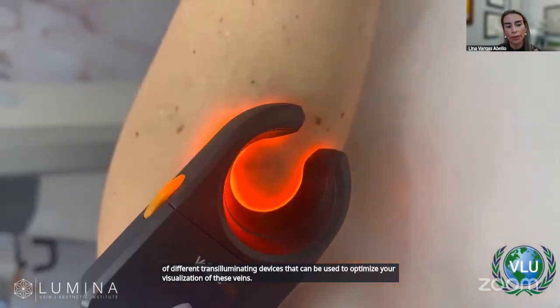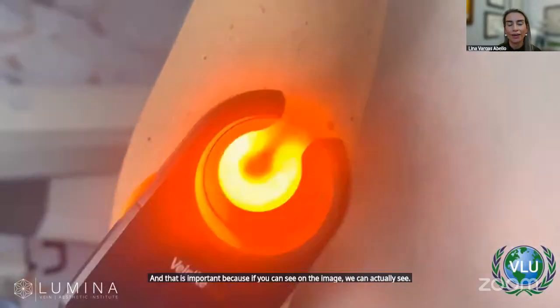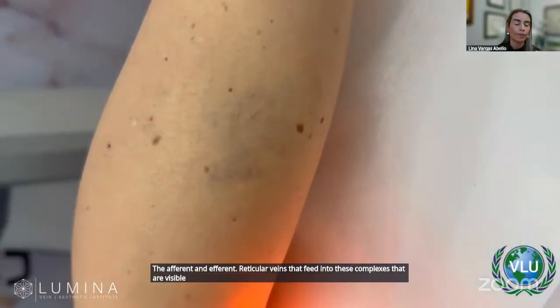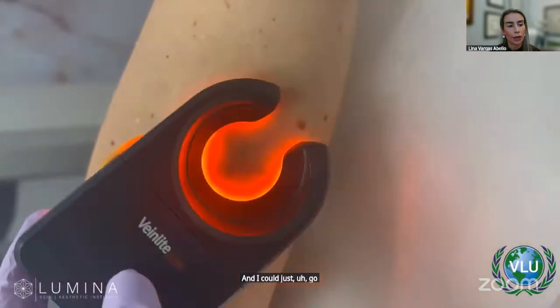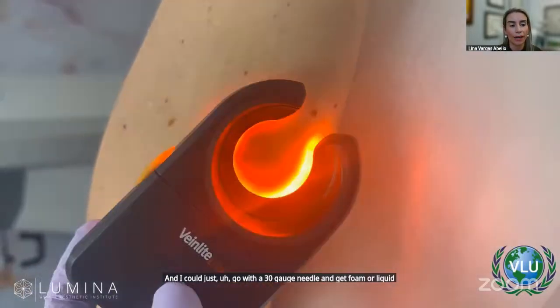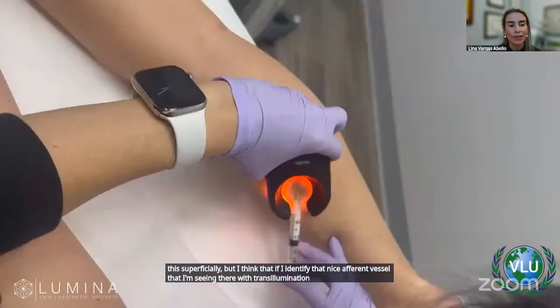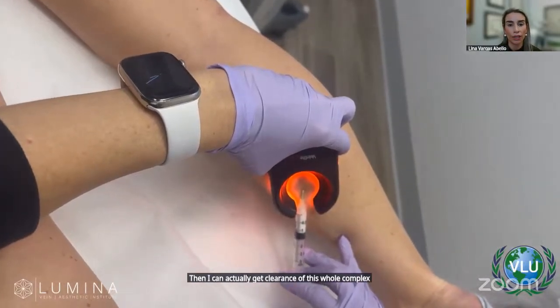And that is important because, as you can see on the image, we can actually see the afferent and efferent reticular veins that feed into these complexes that are visible on the skin. I could just go with a 30 gauge needle and get foam or liquid into this superficially. But if I identify that nice afferent vessel that I'm seeing with transillumination, then I can actually get clearance of this whole complex with a single injection.